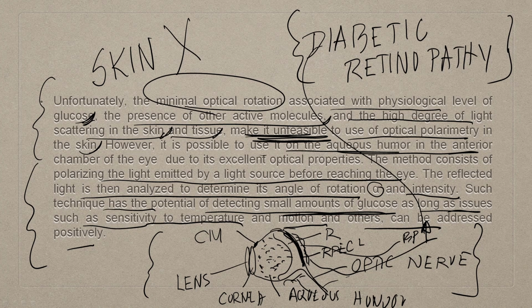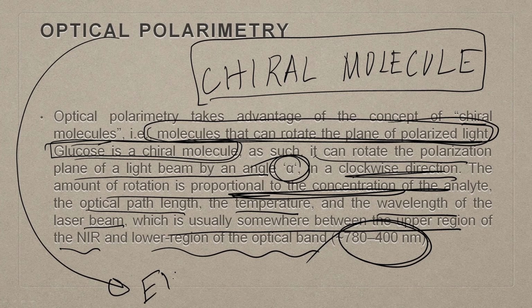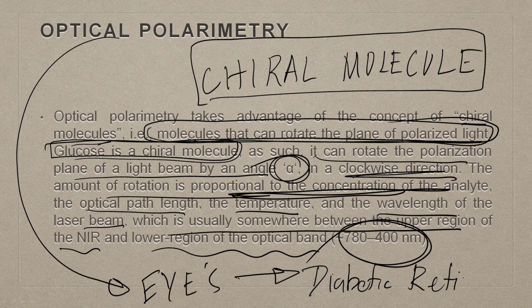So, when you can fine tune this optical polarimetry for eyes, then you really can address the challenge of diabetic retinopathy in a much more elegant manner.